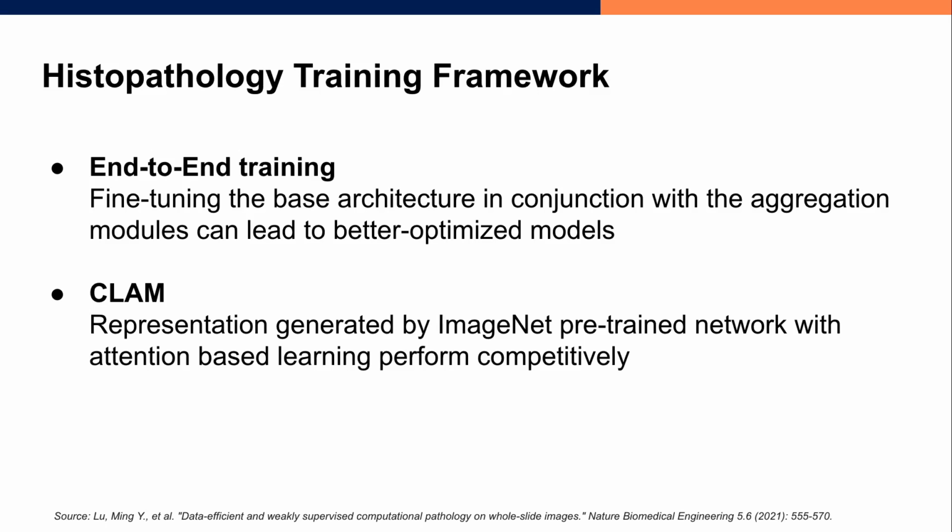In contrast, recently Lu et al. proposed a weakly supervised attention-based learning approach, CLAM, which used a pre-trained encoder to extract all patch representations followed by attention pooling for WSI classification. They showed patch representation generated by Imagenet leads to competitive performance.